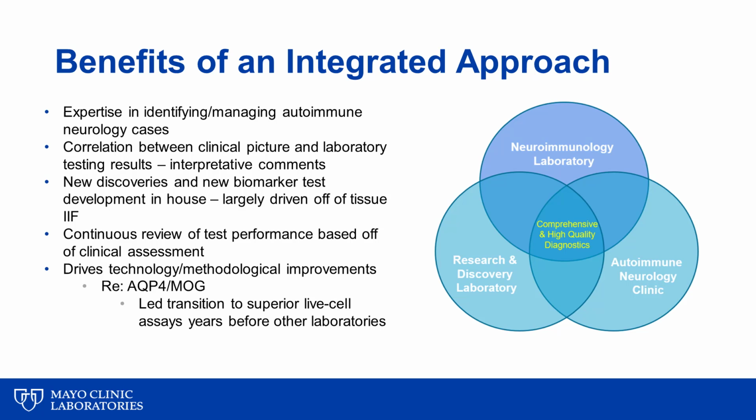Importantly, this makes it possible to more readily review the performance of current clinical tests and determine quickly when they are not meeting the clinical need. Ultimately, this drives the laboratory's ability to develop and implement methodological improvements. Particularly, as an example, I'm going to discuss aquaporin 4 and MOG antibody detection platforms.